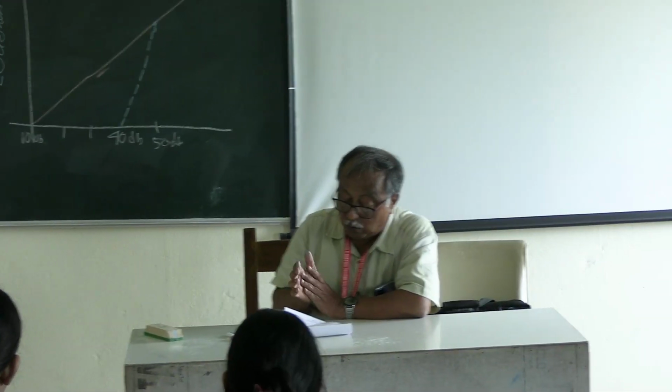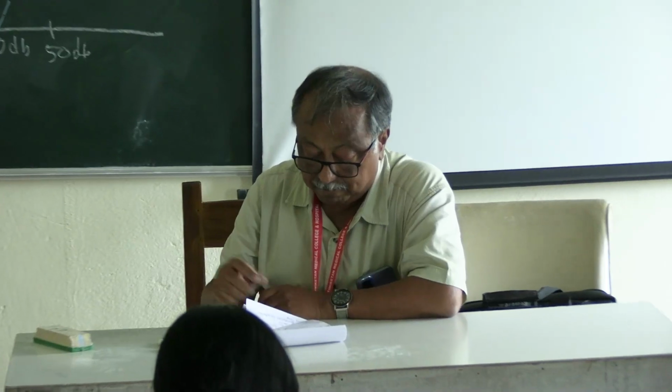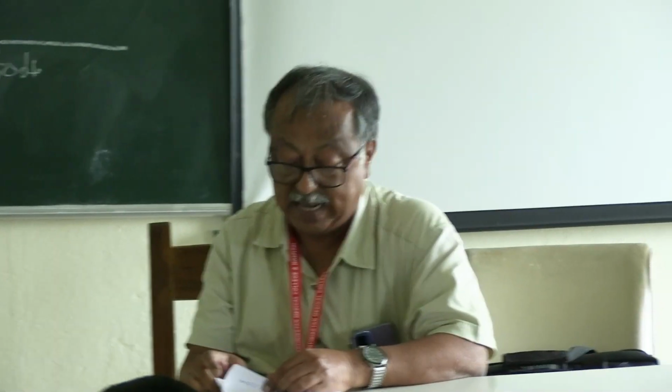By this theory, for loudness balance between the ears, there is a test known as Fowler's binaural loudness test. In unilateral hearing loss, a tone of 1000 Hz is given alternately to the normal and affected ear to match the loudness.